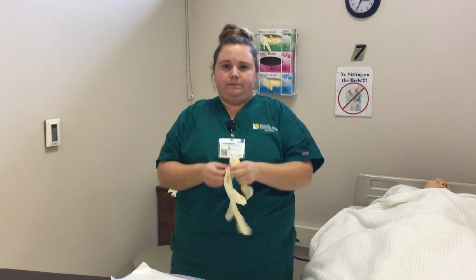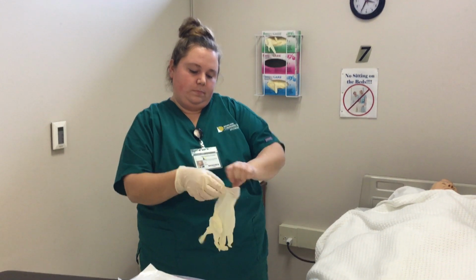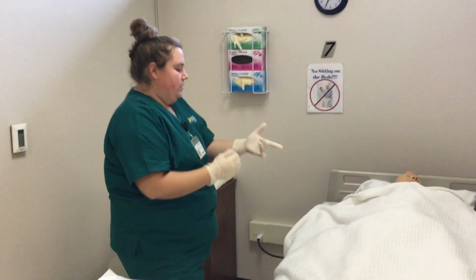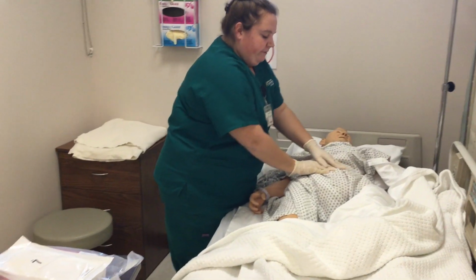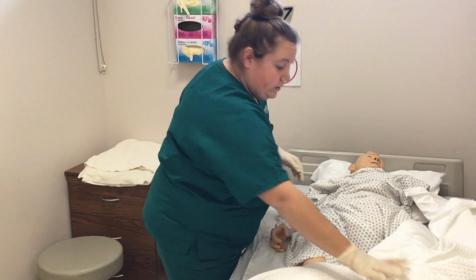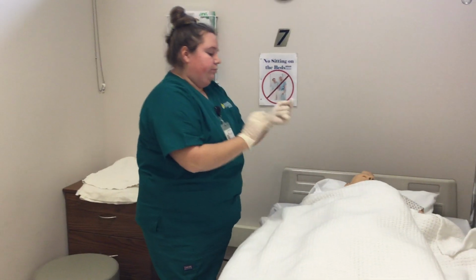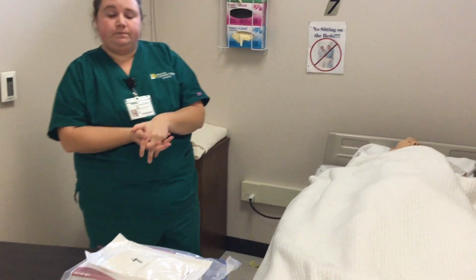apply gloves. Is that my catheter? Yeah. At this time, I'm going to palpate the bladder. If there's a bladder scanner available, I would use that. Then I'm going to remove my gloves and perform hand hygiene.